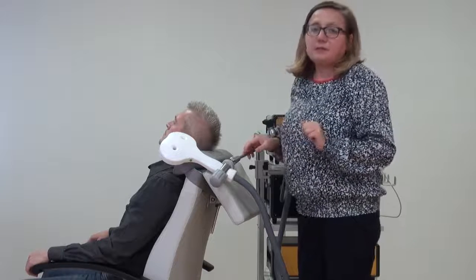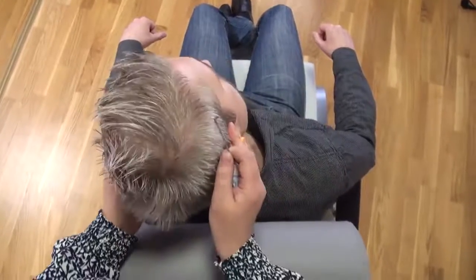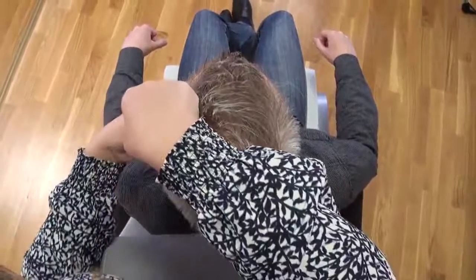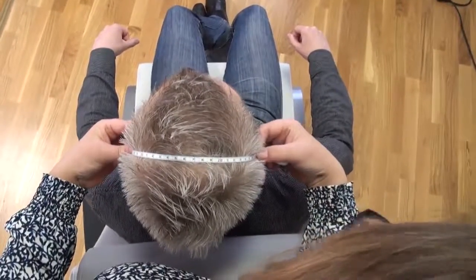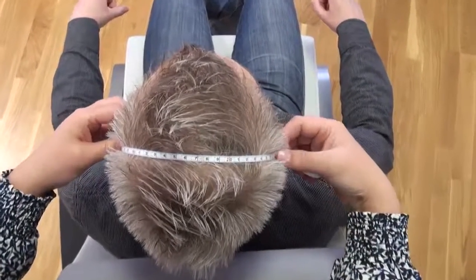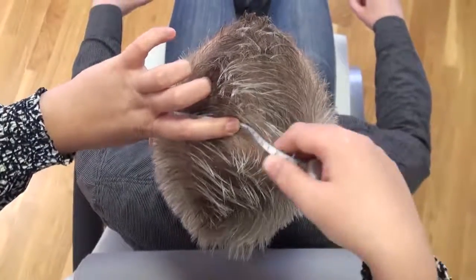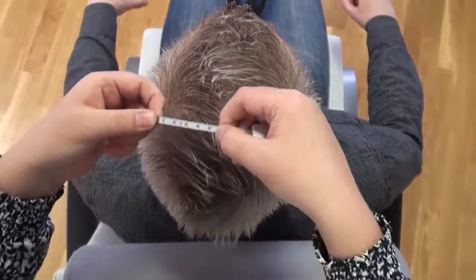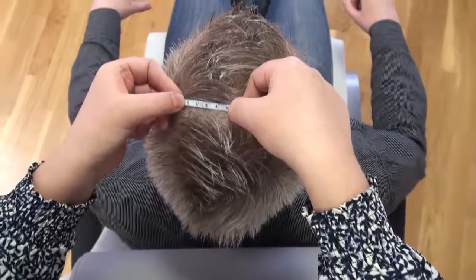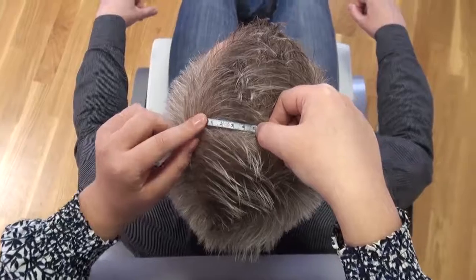Before you start stimulation, we need to find the vertex as a middle point of the line between external auditory meatuses. This is the vertex. Go 5 centimeters leftward toward the external auditory meatus. This is the area where I will begin stimulation.